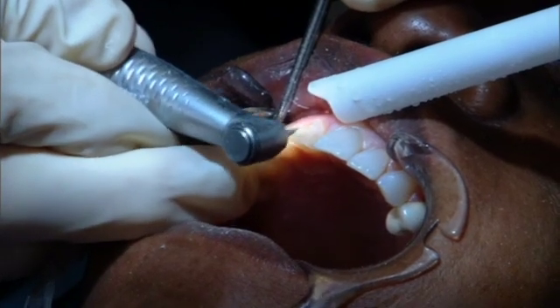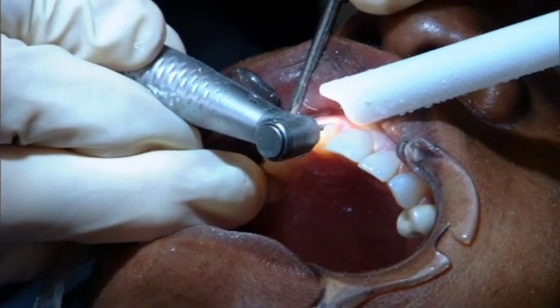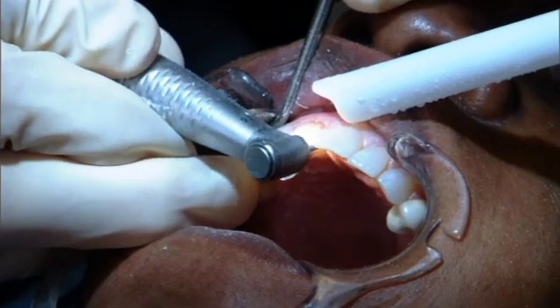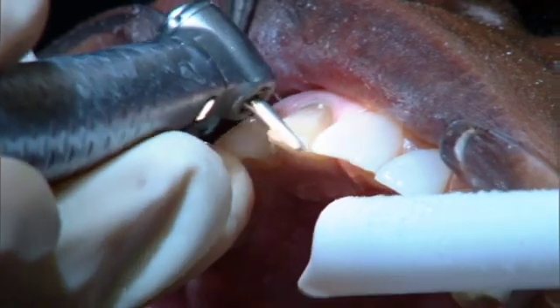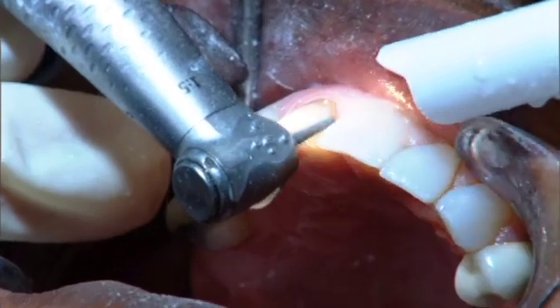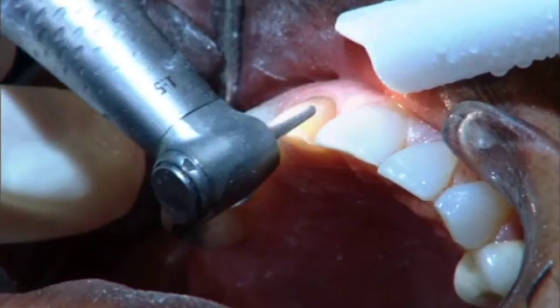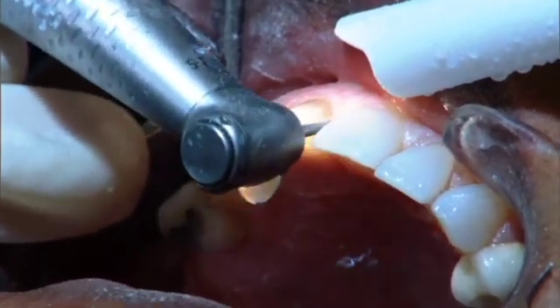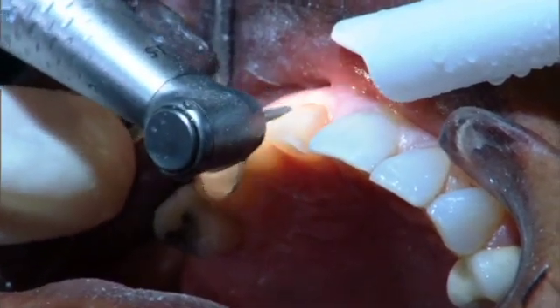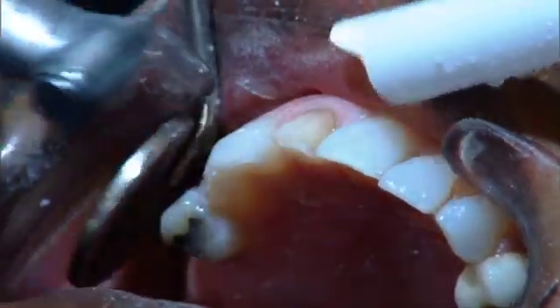This is a super coarse diamond, so I can actually get under the enamel. And instead of sanding or grinding something off, I'm actually shelling it off. This burr is only going to impart a 6-degree taper instead of an 8-degree taper. We'll make sure that we've got a nice 1 3/4 to 2 millimeter shoulder going through the interproximal, so the technicians have plenty of room to give us some good color interproximally.